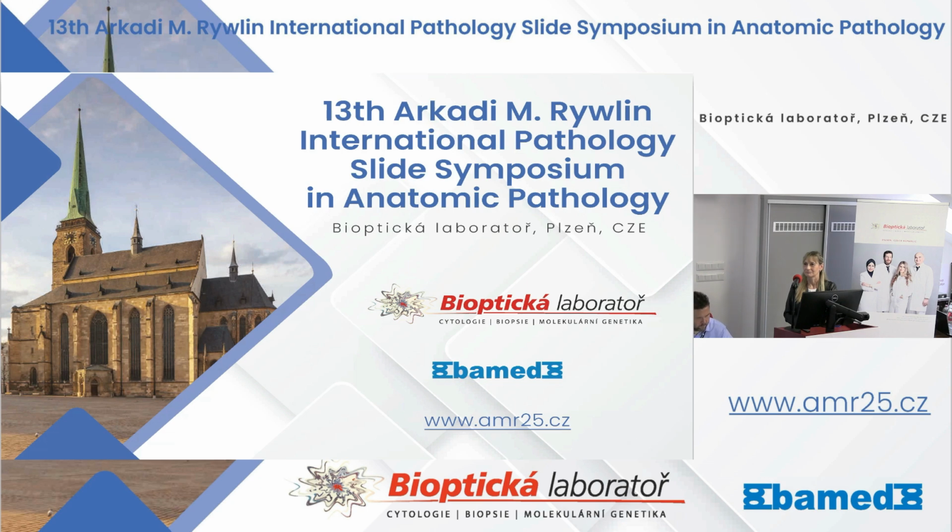Do you think those small neural proliferations like mucosal neuroma in the appendix, do you ignore them or do you report them? This is a very striking example of much more than that. Sometimes people even skip because they don't know. So probably we miss a lot of cases.